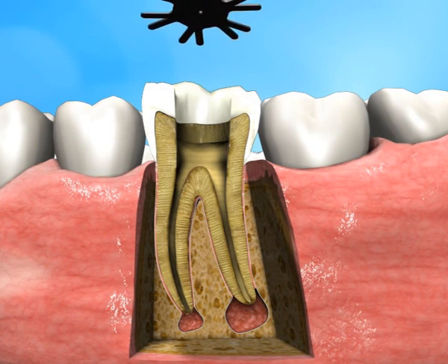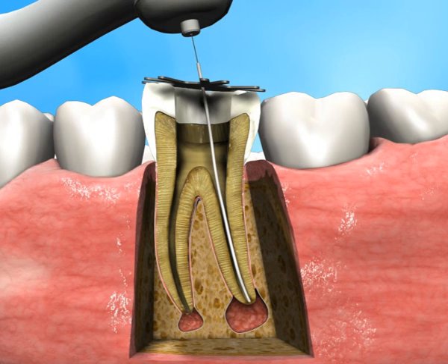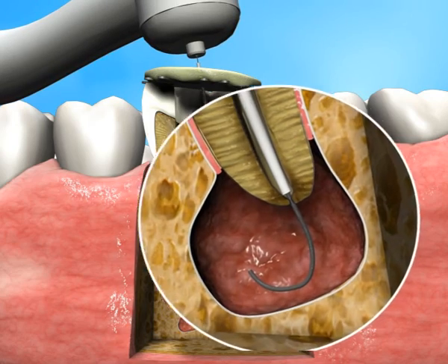After a stabilizer is placed over the orifice opening, the first of two Apexim tools, called the NITI ablator — consisting of a specially designed nitinol blade concealed within a nitinol sheath — is inserted through the canal up to the previously created apical stop. The nitinol sheath is then cemented to the crown, and the ablator is pushed through and beyond the apex into the lesion.